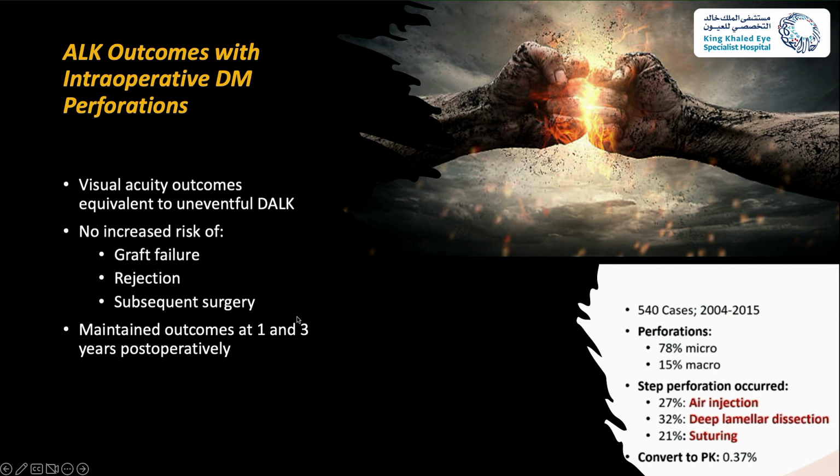The outcome at 1 year and 3 years showed that there was no increased risk of graft failure, graft rejection, or subsequent surgery. And the visual outcome was equivalent to uneventful DALK. This basically tells you, try never to convert, and try to finish the case as a DALK as much as possible to reduce the risk of perforation.